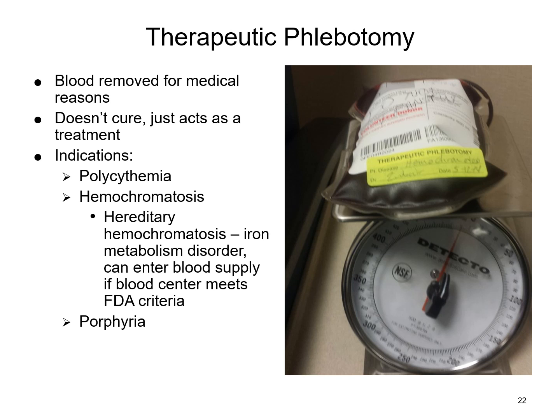It's pretty cool that sometimes when you're working in the lab, you can tell patients that are smokers or potentially have something like polycythemia, because when you spin that tube down, the packed red cell layer is going to be a lot more compared to, I'll give you an example here, someone whose hemoglobin is within the normal range.